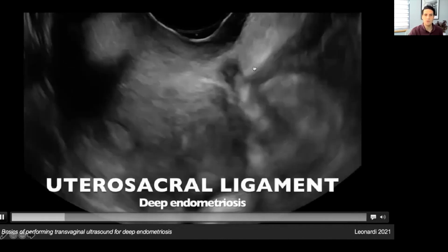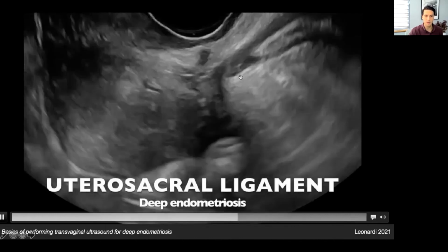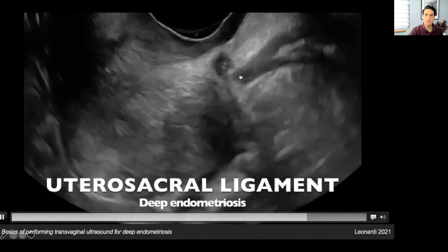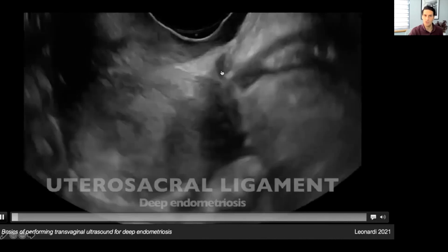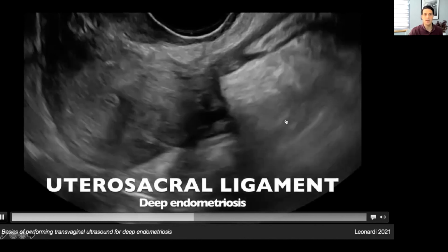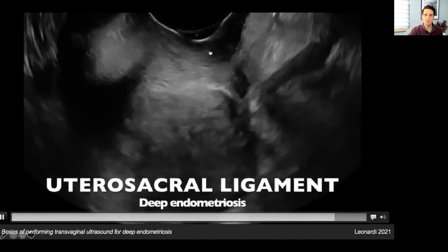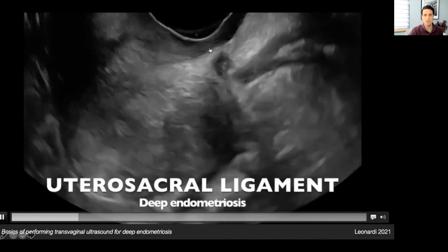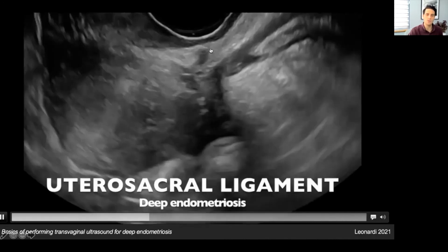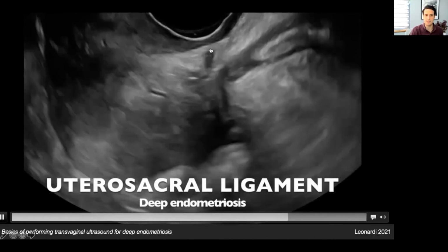I'd like to remind people that the surgical visual of this will limit your ability to understand the nodule in the uterosacral ligament because the adhesion state will not allow you to see deep to it. Tissue is opaque at surgery versus at ultrasound. It is, of course, not opaque. And so ultrasound gives you a very different glimpse of the pelvis than surgery does.